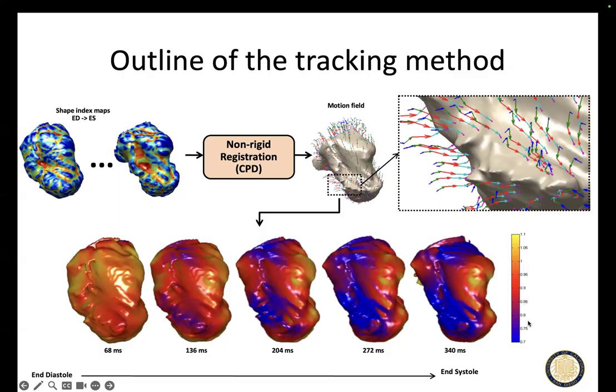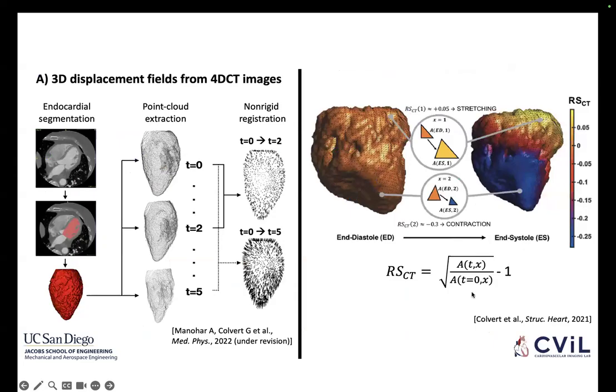And the blue is basically saying anything that's dark blue has contracted by about 30%. If I drew on the heart with a marker here, a one-dimensional line, at this point, that line would be 70% of its original length. It just shrinks down. So I get a functional map of left ventricular function. So it gives localized function, so I can see which areas are challenged in terms of that function.